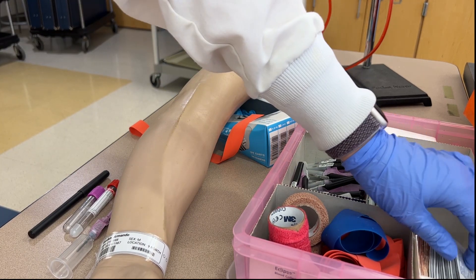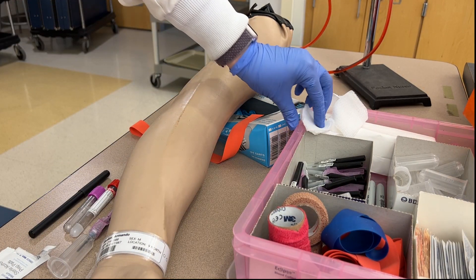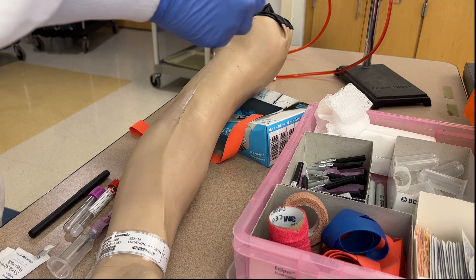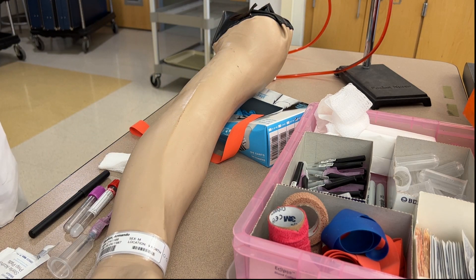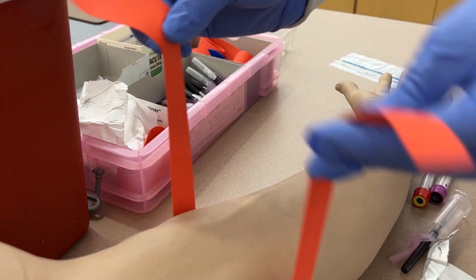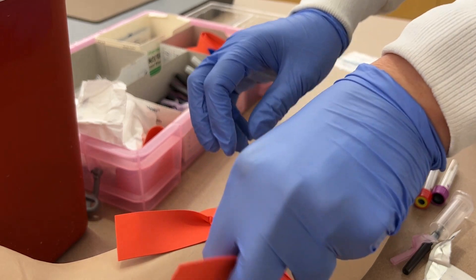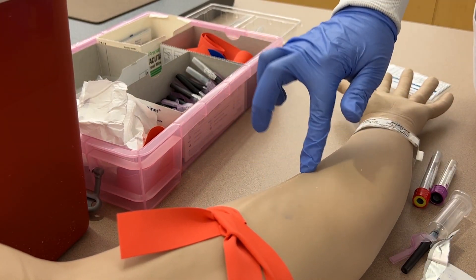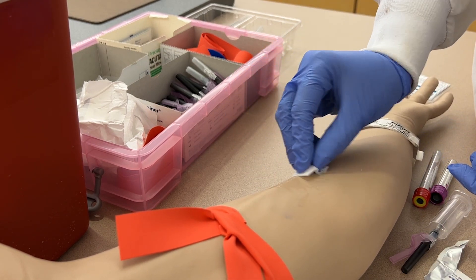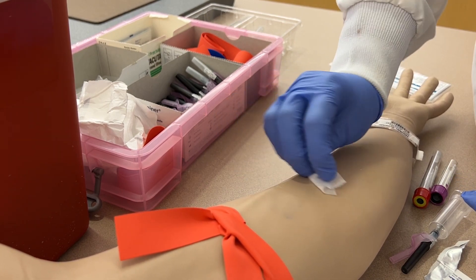Now grab the sterile alcohol pads to clean the patient's arm, open one up and set it on your non-dominant side, along with two pieces of gauze — one to cover the puncture site when removing the needle and another clean one to bandage the patient's arm. Now tie a quick-release tourniquet midway up the bicep by crossing the left tail under the right tail and tucking the now right tail into the band. Palpate for the vein, find any visual markers, then clean it with alcohol by going back and forth across the puncture site. Allow the alcohol to dry before performing the venipuncture.